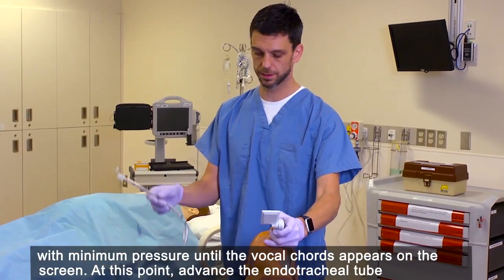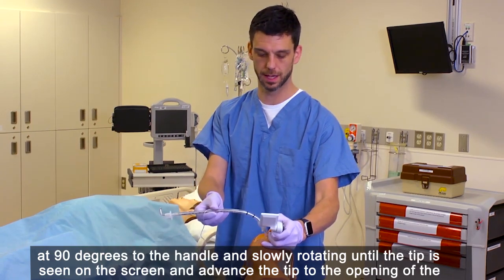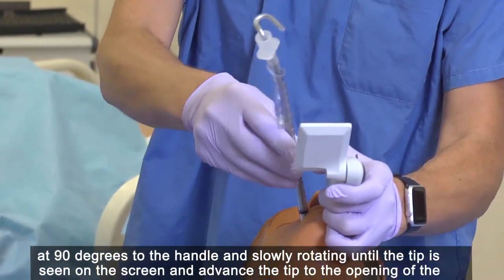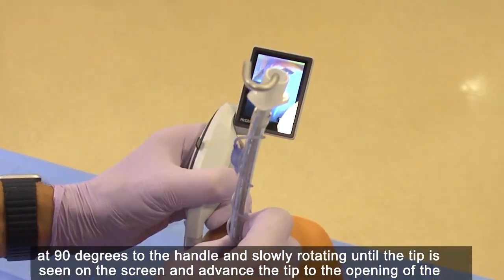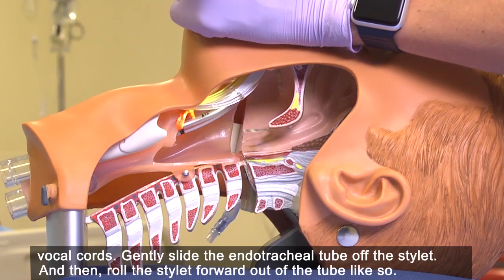At this point, advance the endotracheal tube at 90 degrees to the handle and slowly rotate until the tip is seen on the screen. Advance the tip to the opening of the vocal cords.